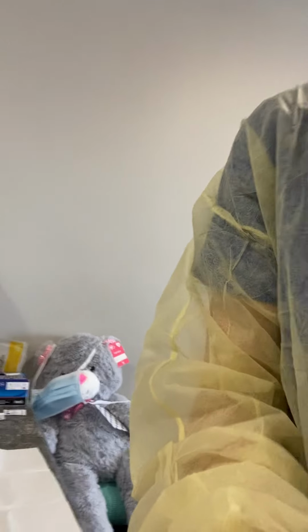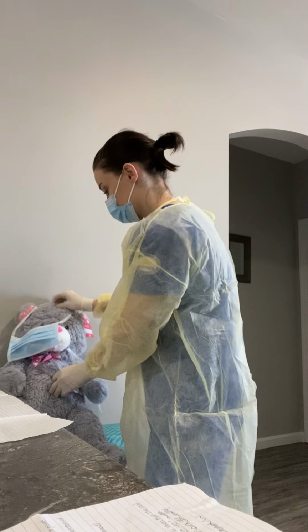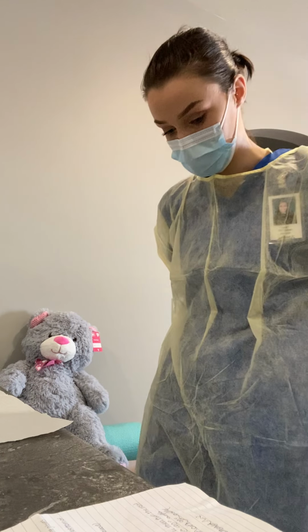Okay. I'm going to move you back now. I'm going to take the dressing off her. Okay, so we've got that done. I'm going to go ahead and take this off.